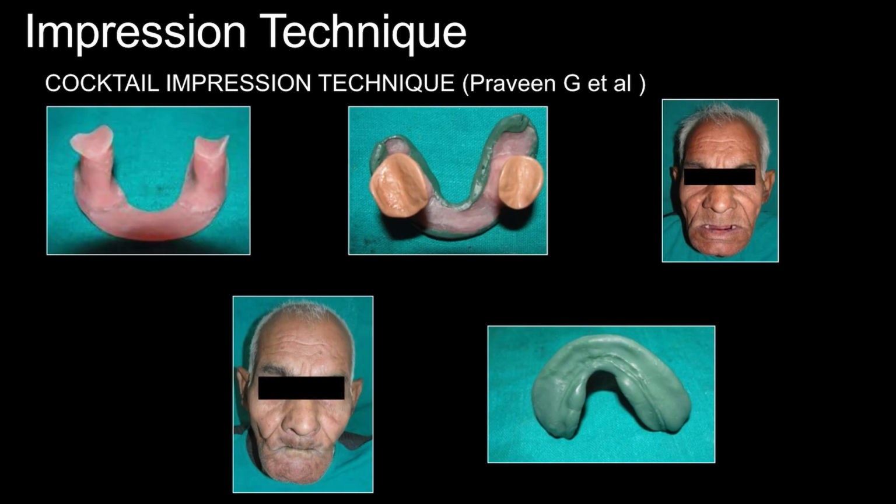Now coming to cocktail impression technique. This technique utilized the custom tray according to dynamic impression technique. Material they have used according to admix technique, and they follow the functional impression according to closed mouth technique. So this is the combination of three techniques, that is why the name cocktail was given.